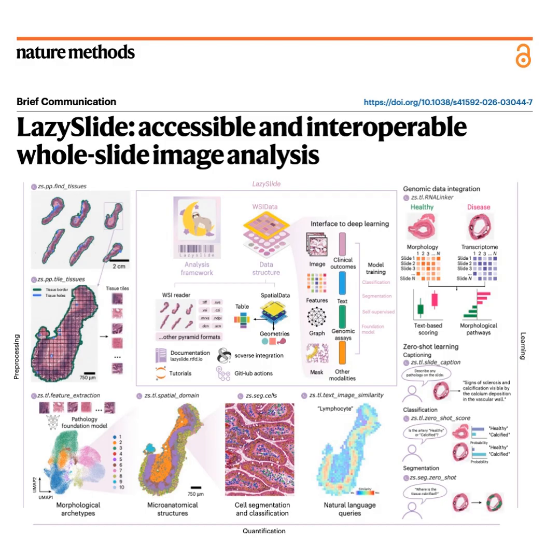But LazySlide goes beyond just finding the visual pattern, doesn't it? It does. It deploys a module called the RNA linker. The RNA linker takes that mathematically derived visual calcification score and bridges it to the RNA count matrix. It runs spatial correlation metrics using Pearson and Spearman correlations to identify exactly which gene expressions are scaling up or down in tandem with the visual severity of the calcification. So they're fusing the visual data with the molecular data.